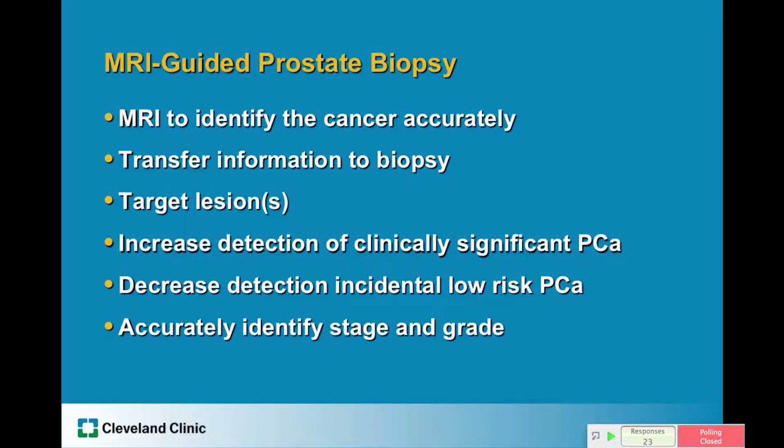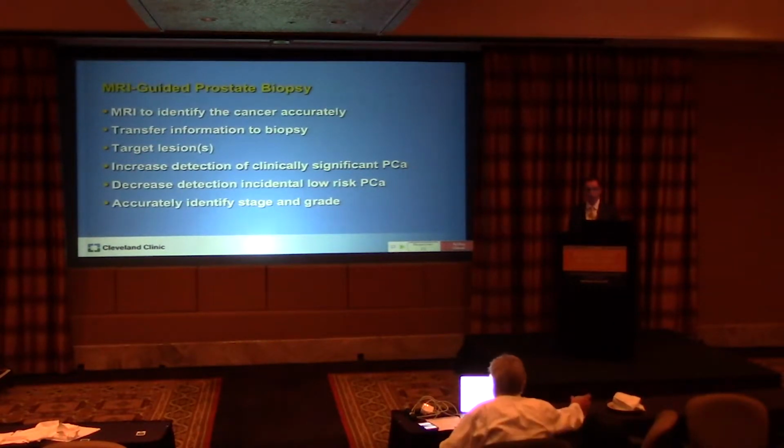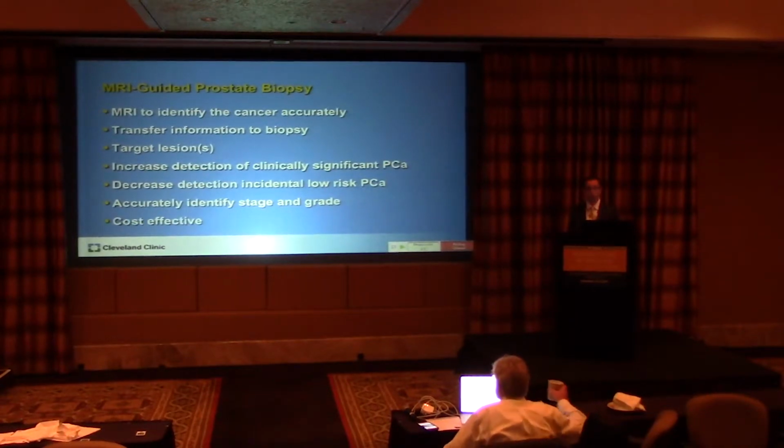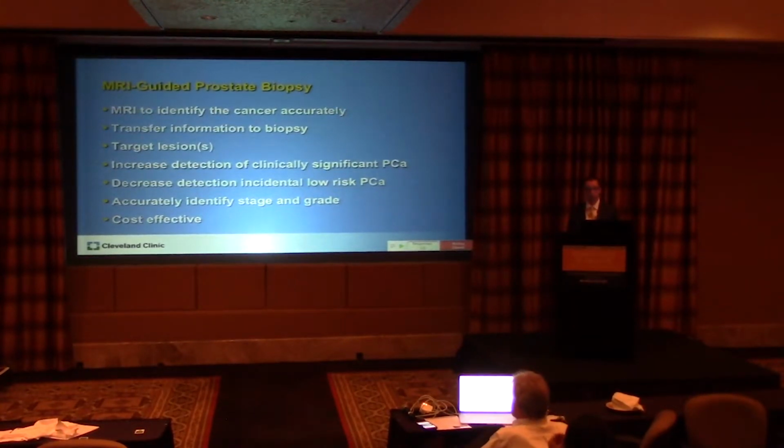the time of biopsy. Ideally, these biopsies would increase the detection of clinically significant prostate cancer and decrease the detection of incidental low-risk prostate cancer. And also accurately identify stage and grade in order to provide information on treatment planning. And ideally, of course, they would be cost-effective as well.